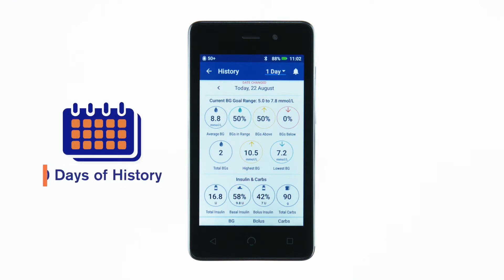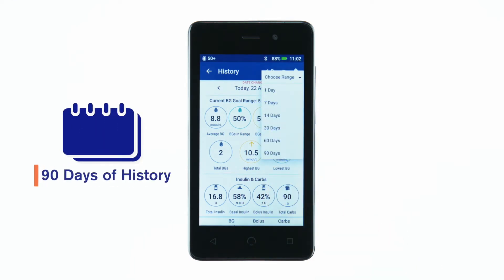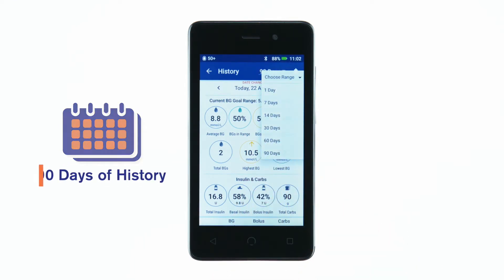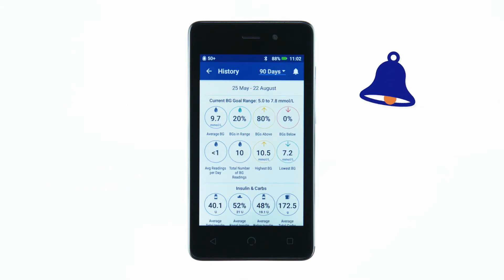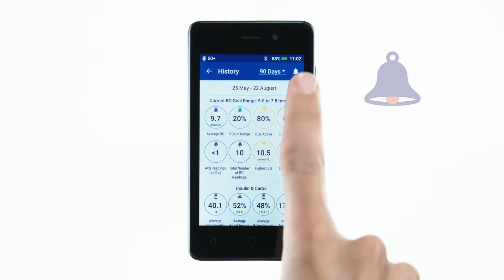The Omnipod PDM can store up to 90 days of history. To review past notifications and alarms, tap the bell icon in the upper right hand corner of your PDM.